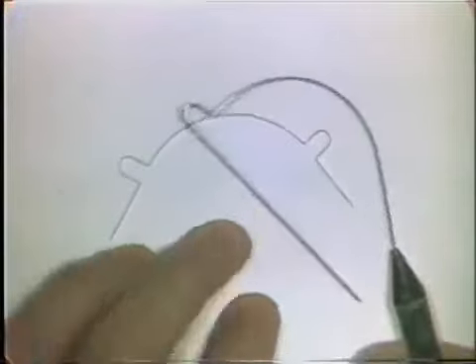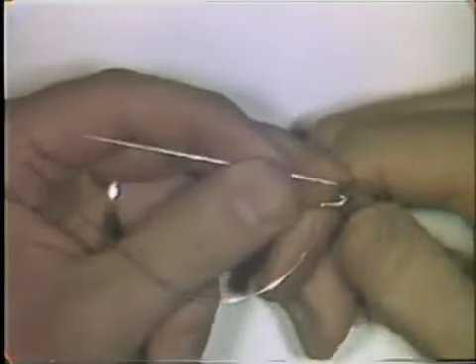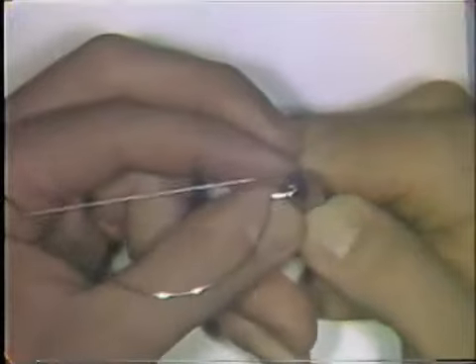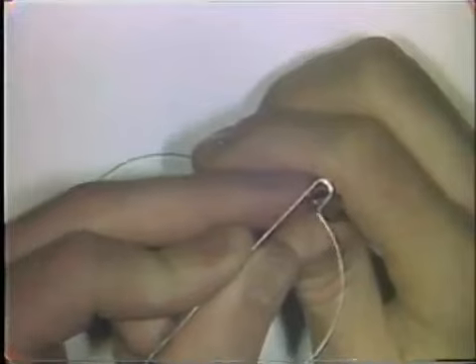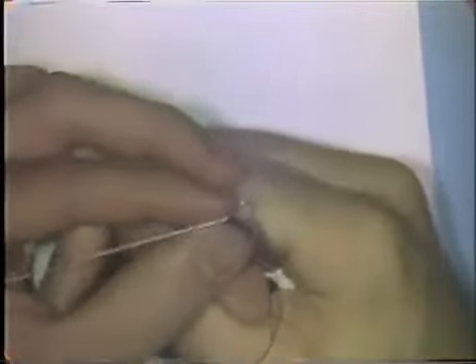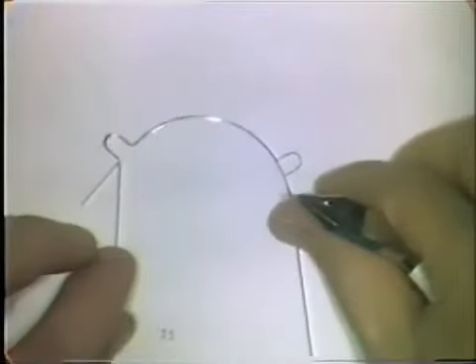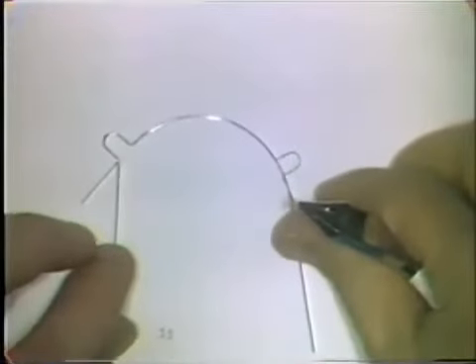We will complete the loop bending using the large round portion of the plier beak, and we'll start the last 90-degree bend by placing the wire in the beaks of the plier near the small end of the beaks. You make the first preliminary 30-degree bend and try the wire back on the pattern to see if your 90-degree bend start is located in the right place.